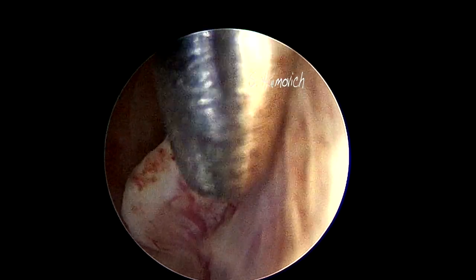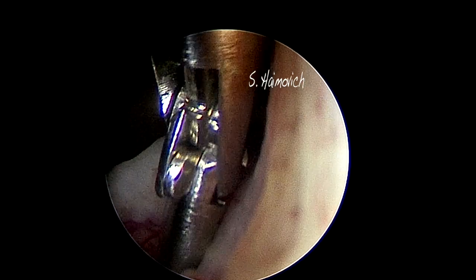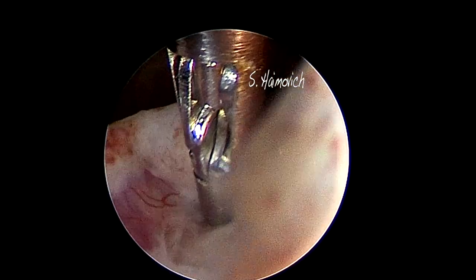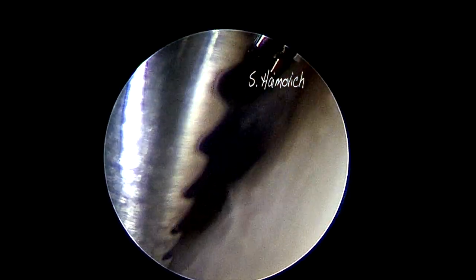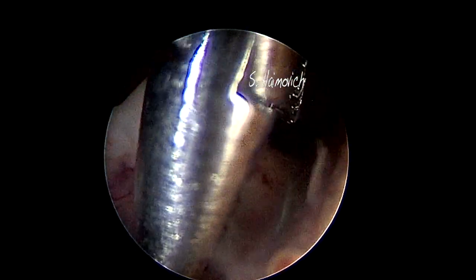The grasper must be parallel to the implantation wall. Open it widely, close it on the polyp base, and then push gently. Never pull. Open it again, release the polyp, and then repeat the movement until the polyp is completely free.